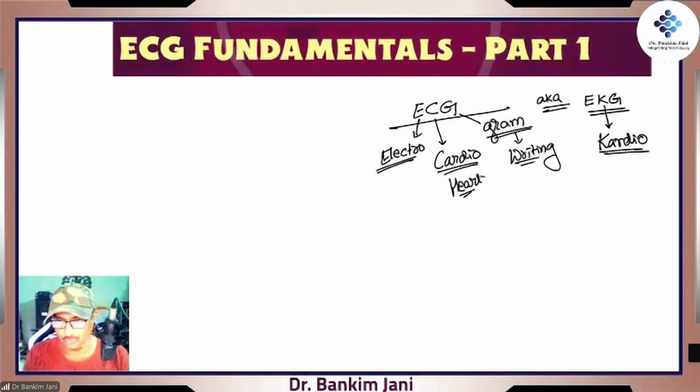But in order to know this thing, it will help you a lot when you'll see any of the ECG. It is my responsibility that by the end of today's session, if I say we are now talking about lead number 1, immediately your face should turn, yes, we are watching the heart from the side. If I say lead number 2 and 3, then immediately within a split second, it should come to your mind, yes, we are watching from below, correct?